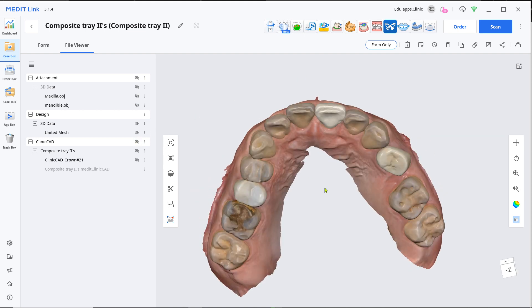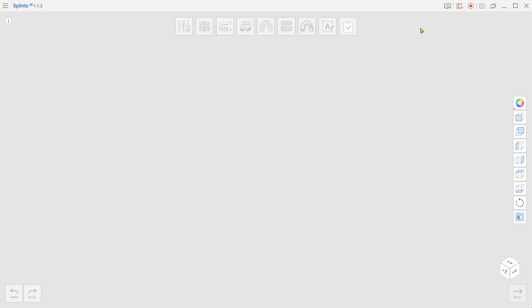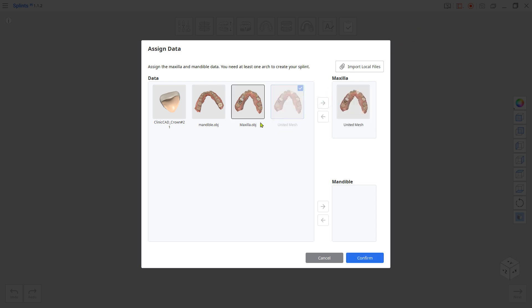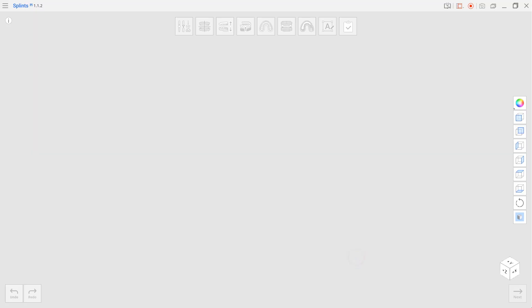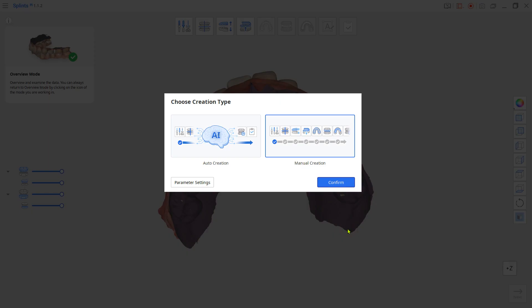Load the Splints app. Assign the united mesh to the maxilla. Select the arch and Michigan for type. Select Manual Creation.